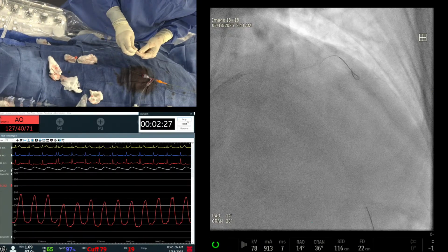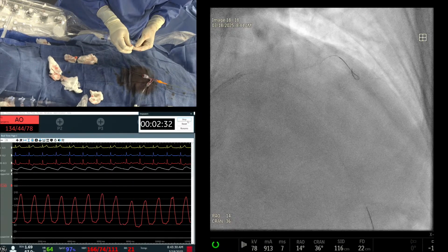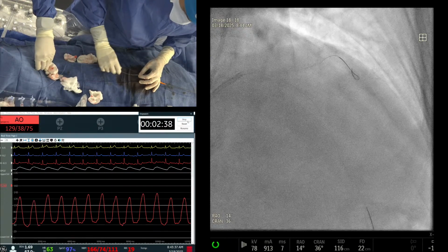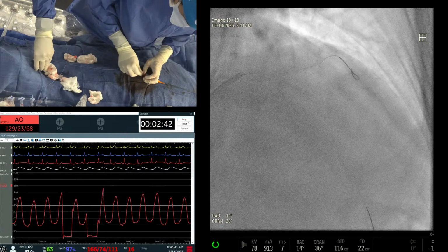I'm going to do a quick IVUS, so after balloon we can see what has happened. Okay. Sure. Meanwhile, can you show those app slides, Yulia? Without means we didn't do IVUS before.